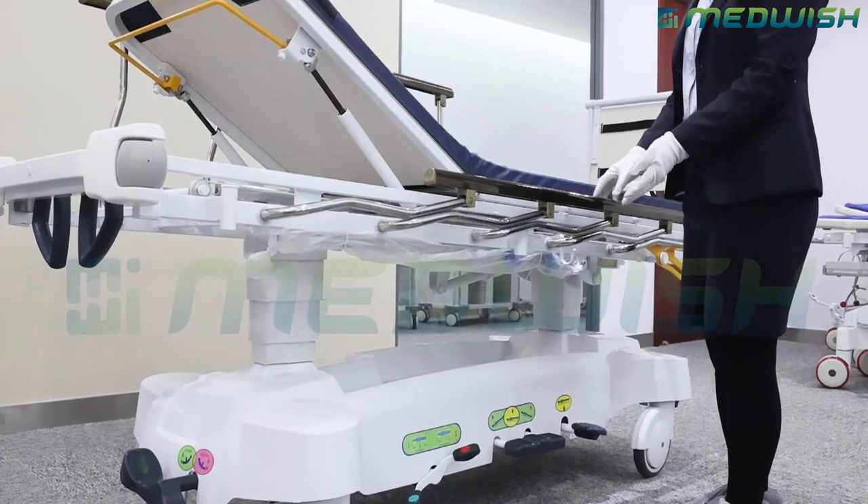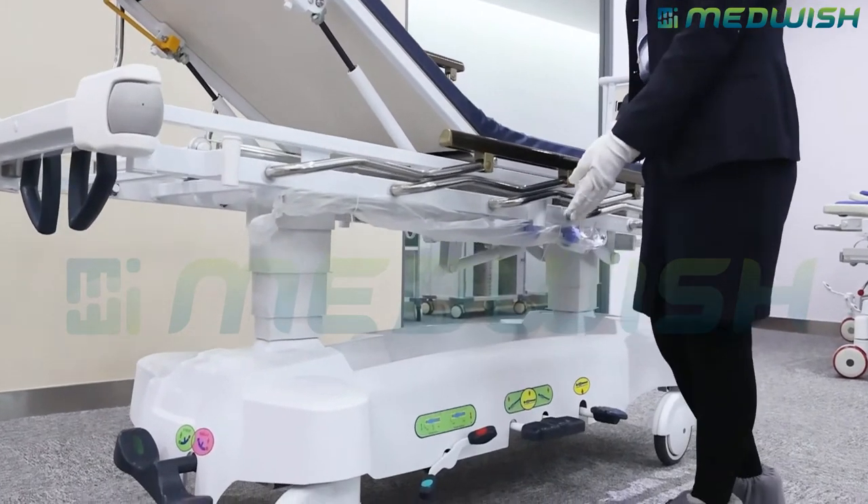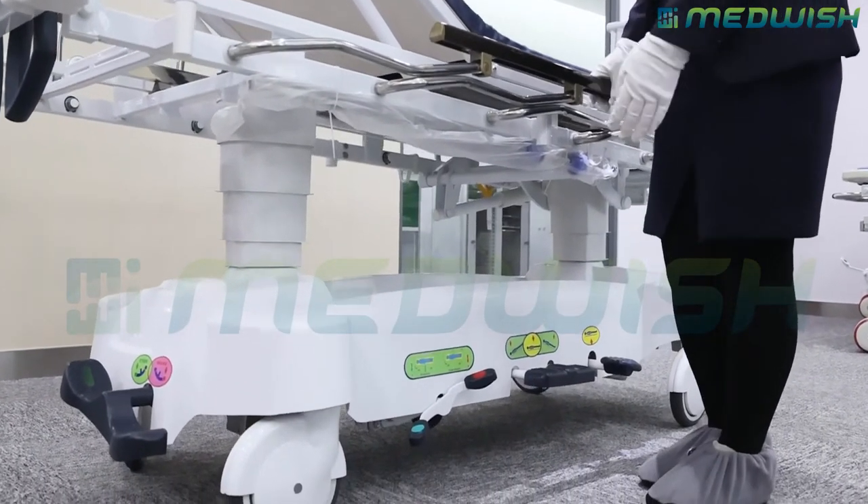There is also a third pedal. This one controls the fifth wheel of the stretcher.